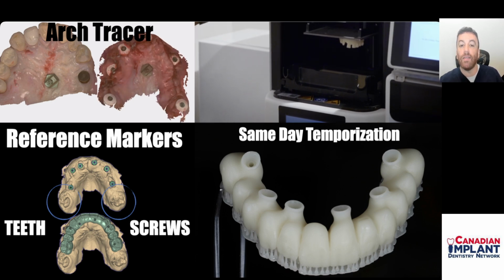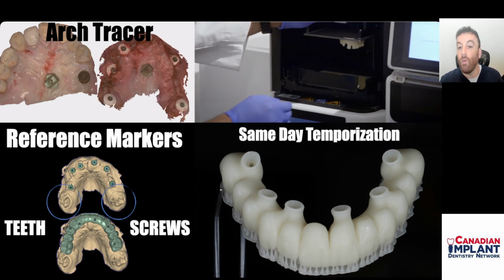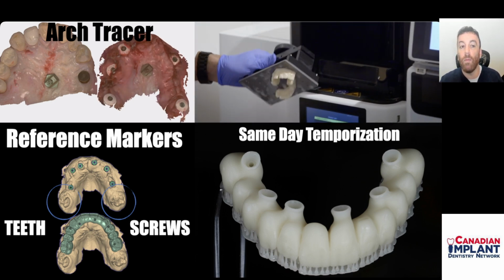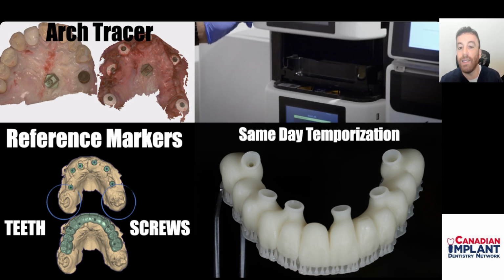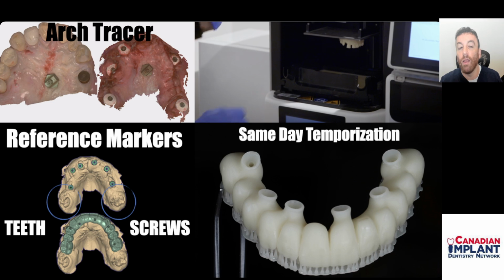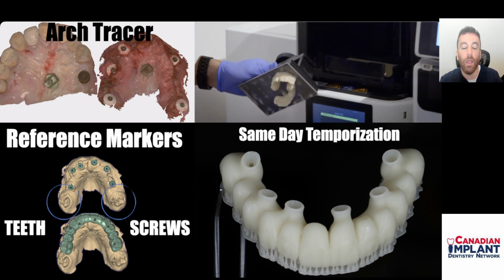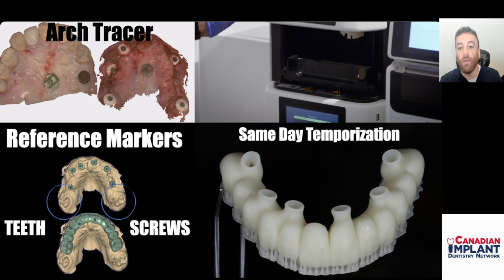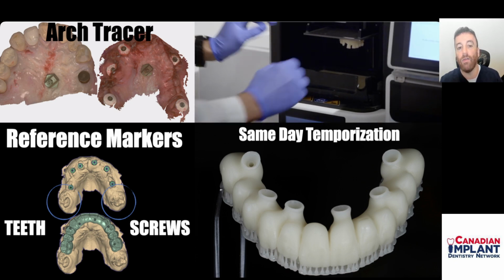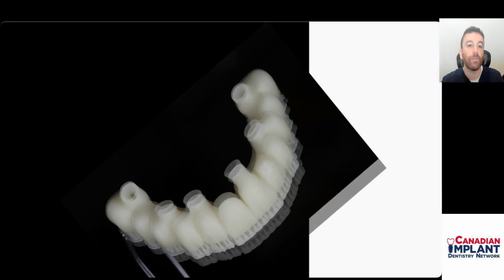These get placed at the start of your surgery, at which point an intraoral scan is performed and stays throughout the surgery. Now, this provides a consistent reference marker that allows you to take your surgery, midpoint, and endpoint to the same referencing position for your data to stack together in your design software.